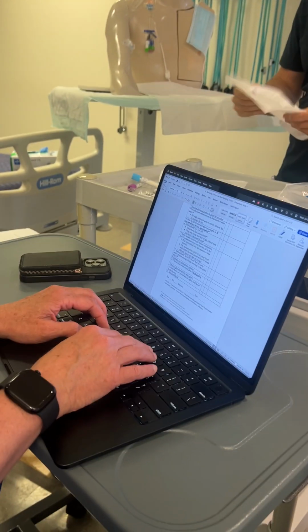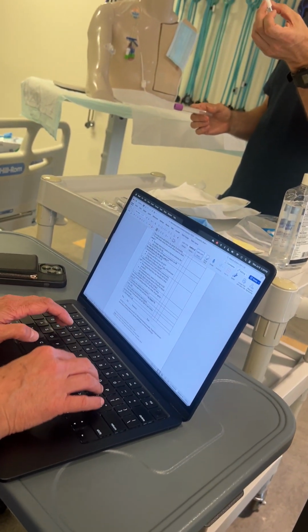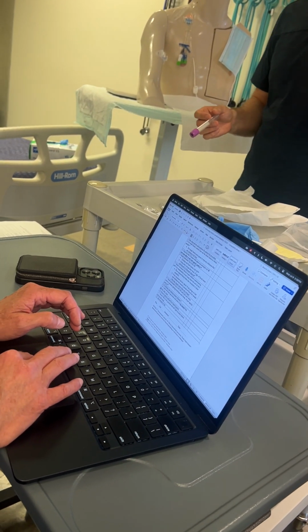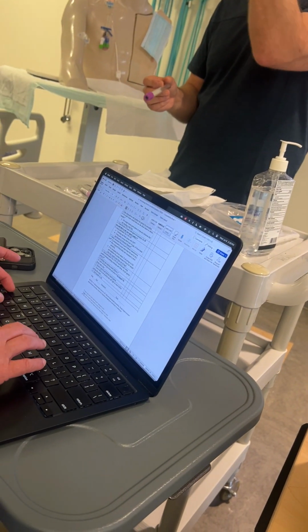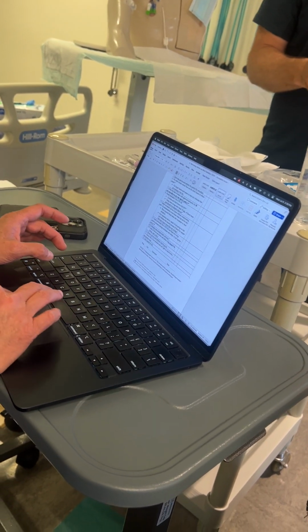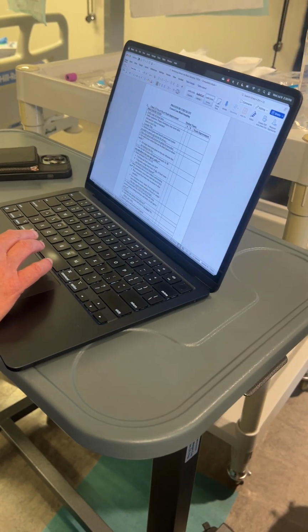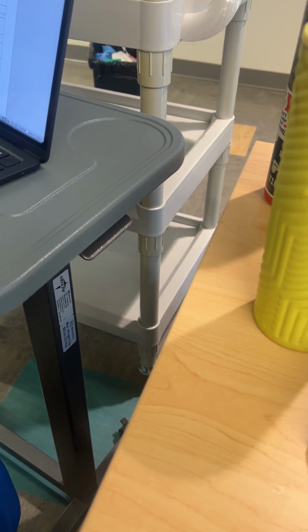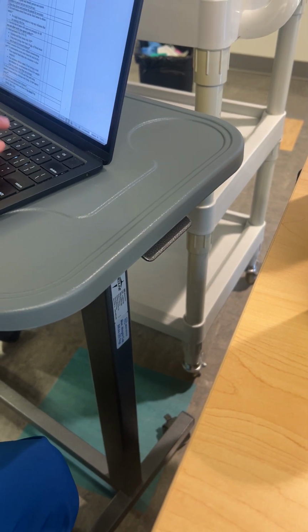Okay, so I'm actually going to be drawing. Lab came up and drew a CBC or a CMP earlier. So what is this tube for? Yeah, INR. This is a coagulopathy tube. So anything coags is in here, right? PT, PTT, INR, D-dimer, right? All in here. Indicated by the blue. And if you guys know your labs, like the different tubes, it's actually helpful because then you can figure out what you need ahead of time.